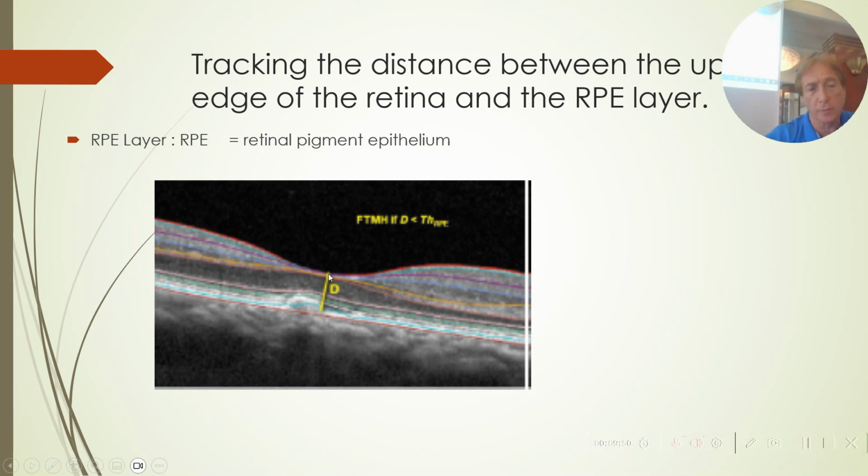And the last algorithm that we apply, we're measuring the distance between the macular hole, this is our macular hole, and the so-called retinal pigment epithelium. It is this layer. And this distance is very important. If this distance is too short, then we also have a pathological case.